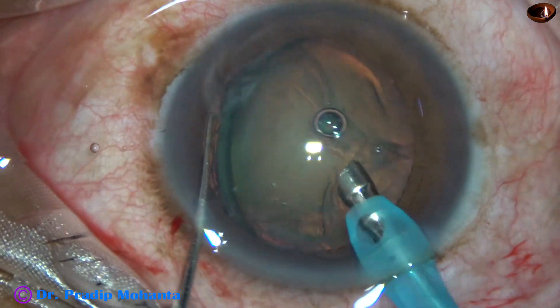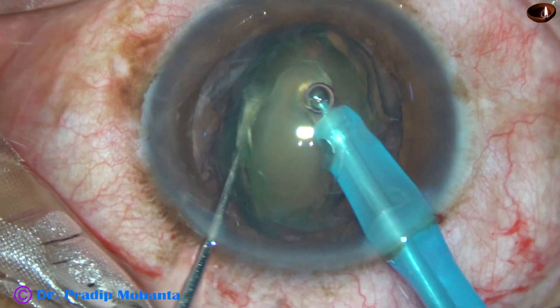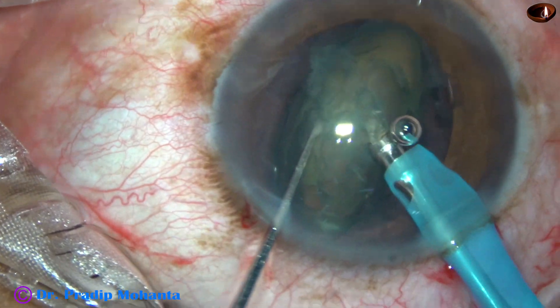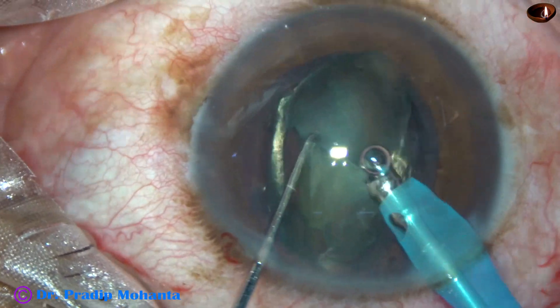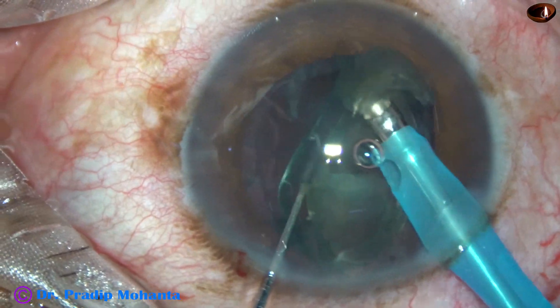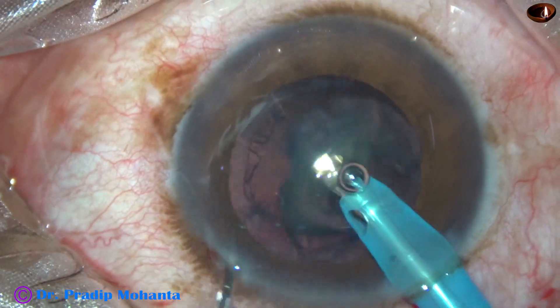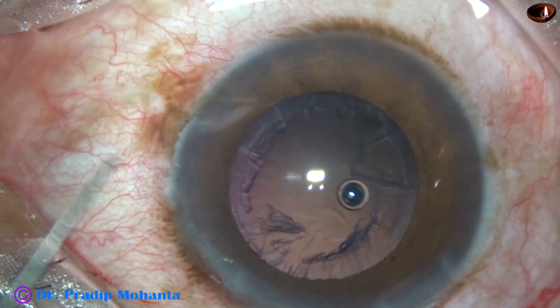Here are four sculpts performed — one, two, three, four — and a portion of the nucleus is eaten off. Now the nucleus is divided into two halves, and emulsification proceeds from above downwards. The nucleus is removed and the boat-shaped nucleus is removed in no time. This is a very efficient technique for soft cataracts.